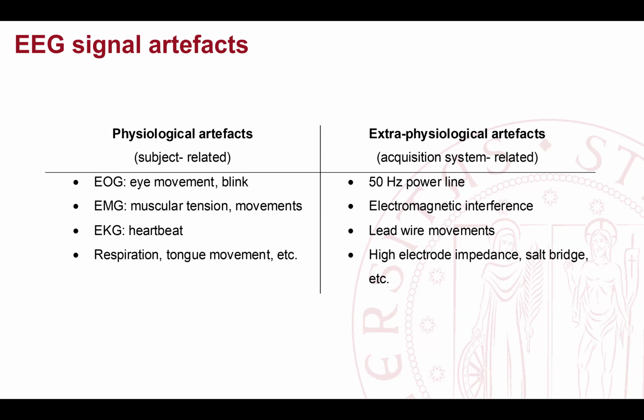Just to let you know, it was actually a combination of the two. For a European project, I had to work on a data set of walking with and without an exoskeleton with an EMG and EEG signal. It took me 1 year and a half to clean the data of 10 subjects, and I think 1 month to implement the full BCI. So the main part was cleaning the EEG, and then it took 1 month only for the BCI part, the analysis, and the publication. But 1 year and a half just for cleaning. So no, it's not easy.